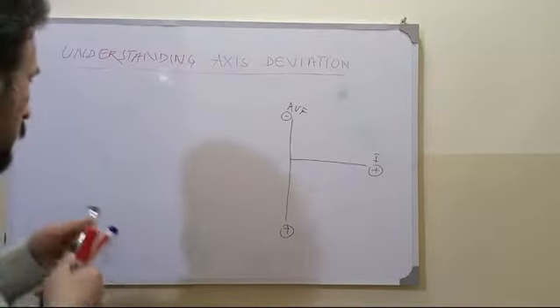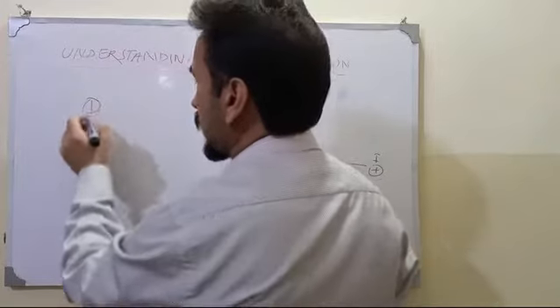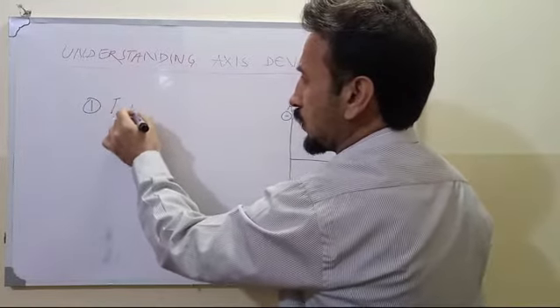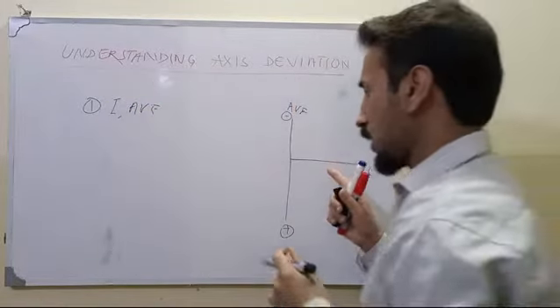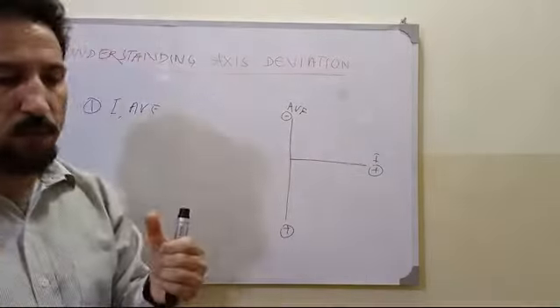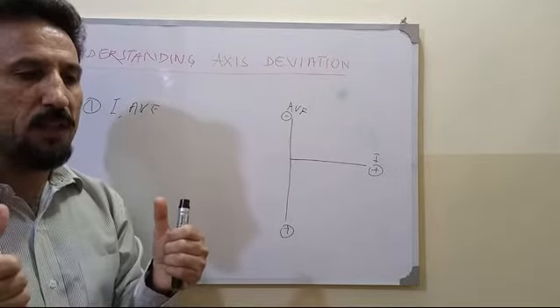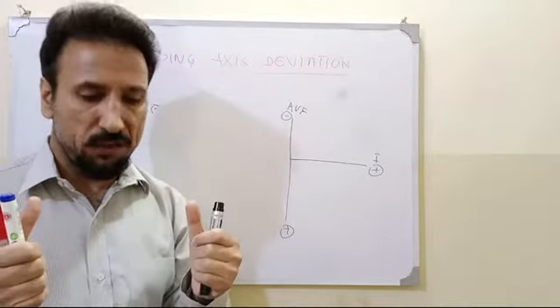The first method, which is called the two-thumb method, takes into account lead 1 and AVF. I have drawn the diagram before. This states that if the QRS complexes are upward in lead 1 as well as in AVF, the vector is normal. It is lying in the normal orientation.